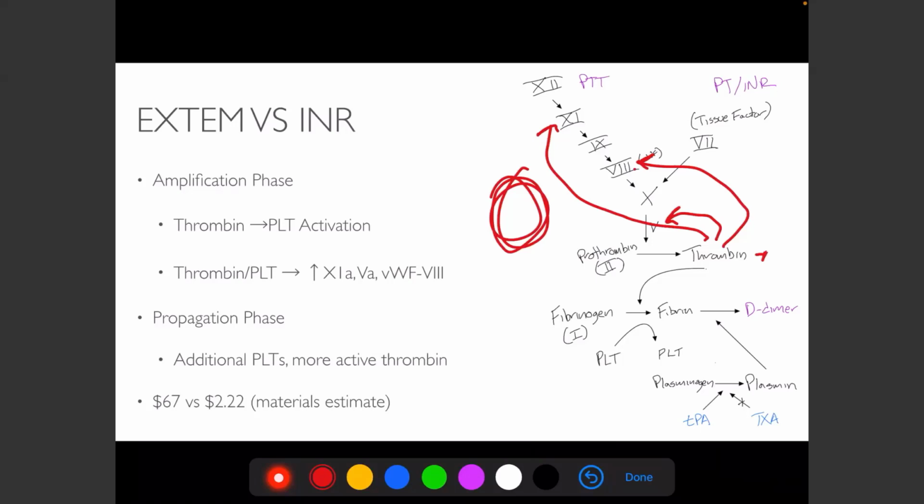And I think that's one of the most beneficial times to use something like Rotem that's a little more advanced. It's a similar product where if they're amplified platelets or activated platelets compared to just the platelet number, it makes a big difference because we see patients with HIT where your platelet count is 20, but they're having clots all over their body. I mean, it's a similar process. You can't just take a number to identify somebody's coagulopathy.